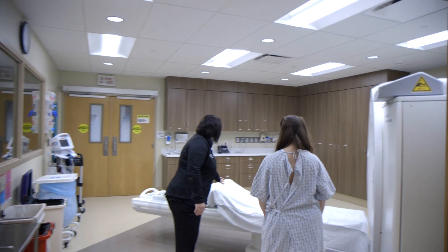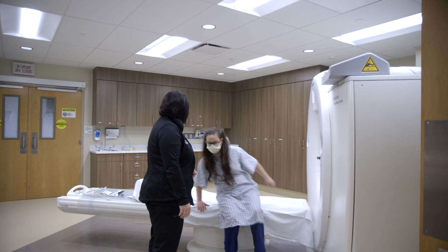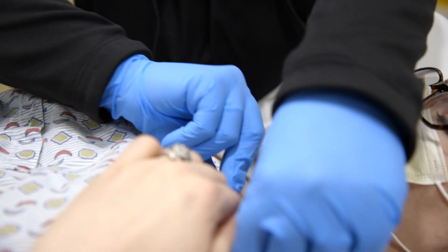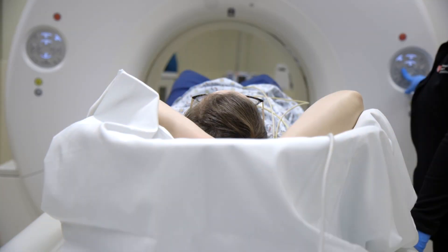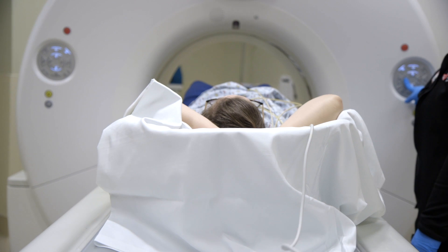During the test, a patient will come in and be met by one of our technicians. They'll often be placed in a gown and have some heart monitoring leads placed. After that it's very simple — the patient lies in a CT scanner, goes in for a one to two minute scan and then comes out. After that we'll quantify how much calcium is in the arteries of the patient's heart, and that gives us an idea of the patient's risk. What will be produced is a number which gives us an index of the amount of calcium in the major coronary arteries.